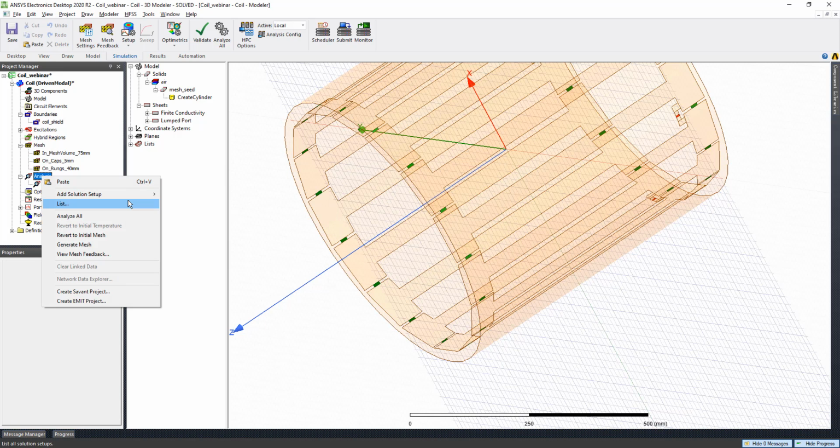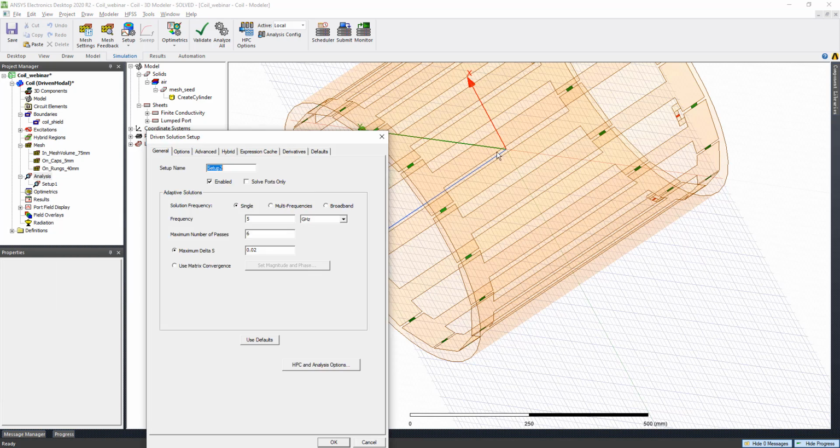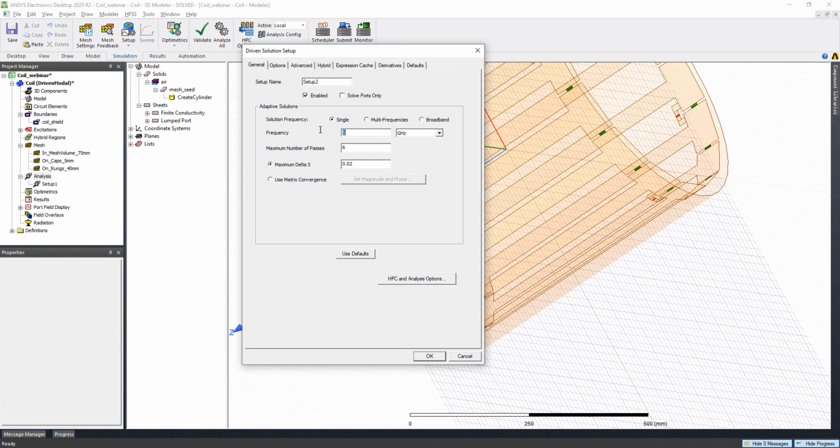The next step is we're going to add a solution setup. We'll add advanced, and in this case, I'm not doing any frequency sweep. I just set the frequency at the operating frequency, which is 63.8 megahertz.